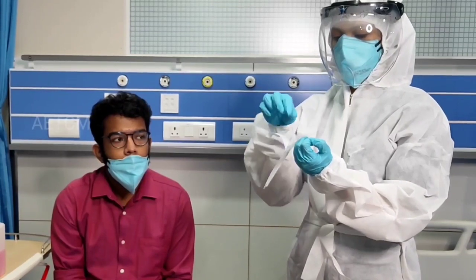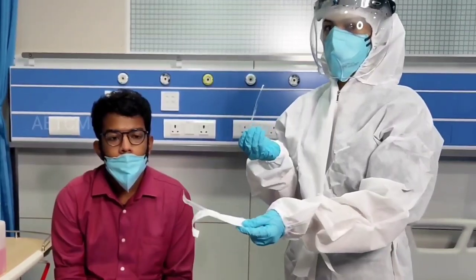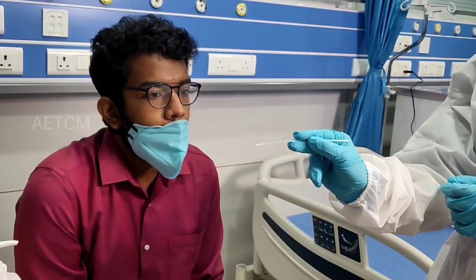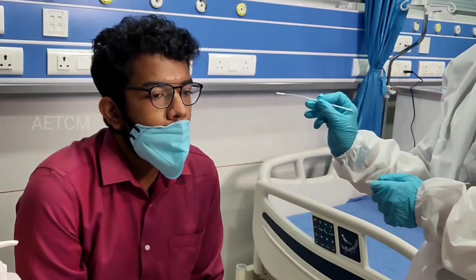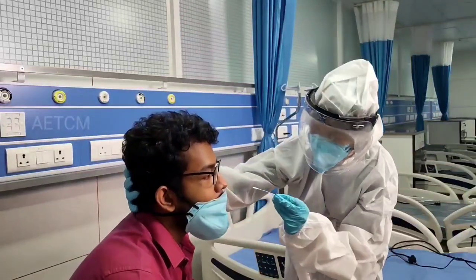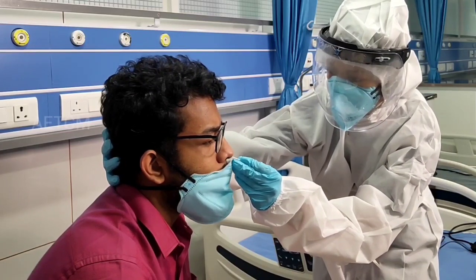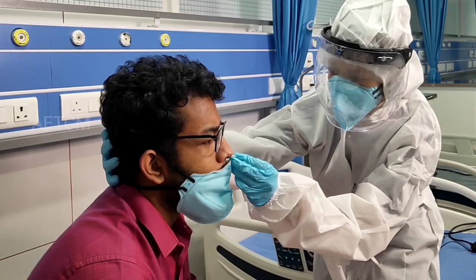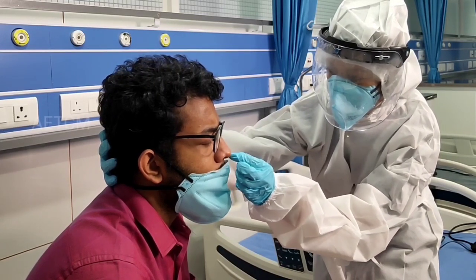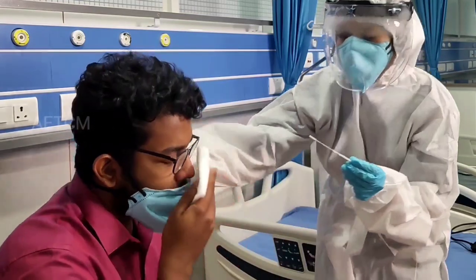Moving on with the test procedure. First, you open the sterile packed swab carefully. Then insert the sterile swab into the nostril of the patient, reaching the surface of the posterior nasopharynx. Swab over the surface of the posterior nasopharynx. Then withdraw the swab from the nasal cavity.